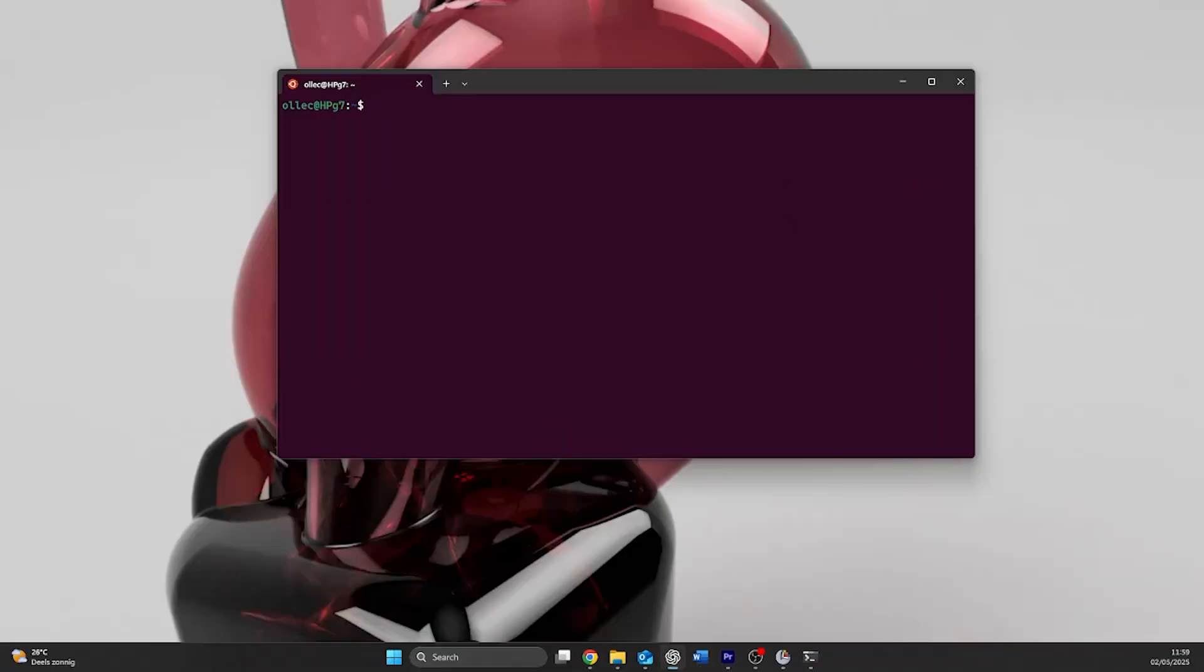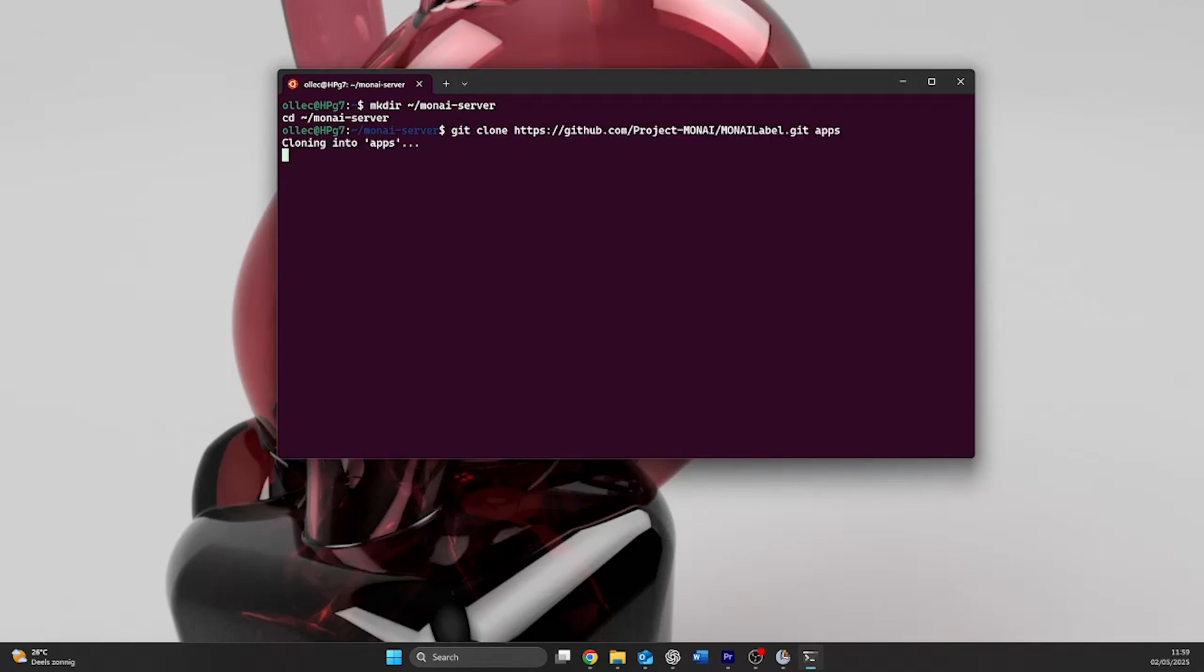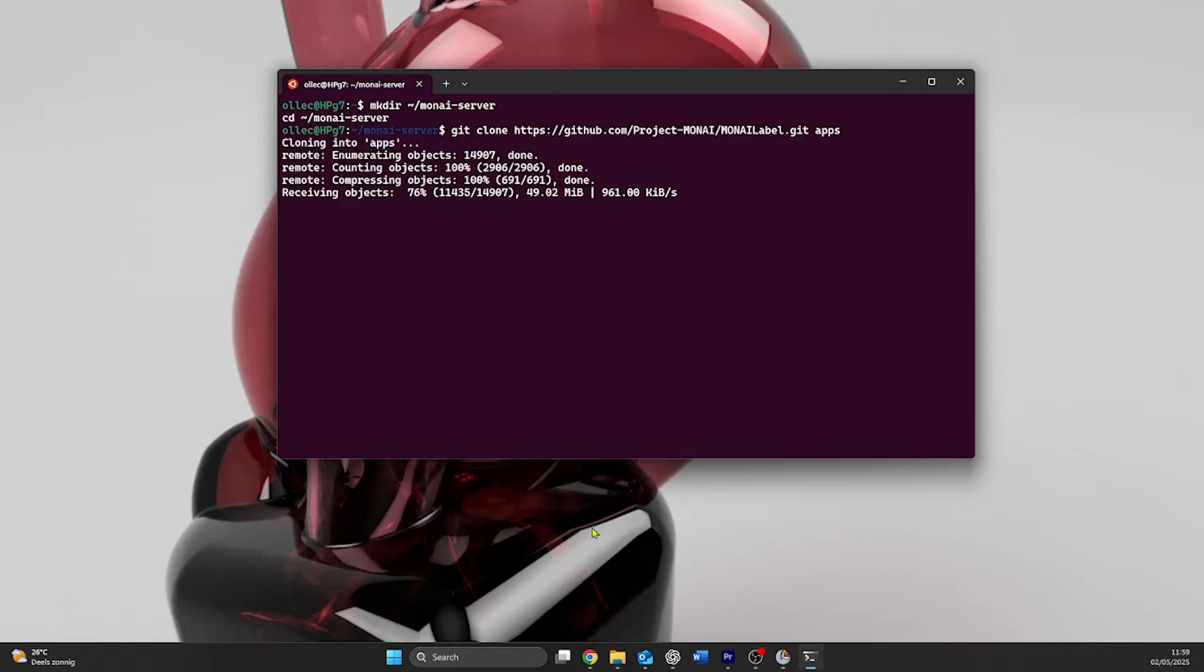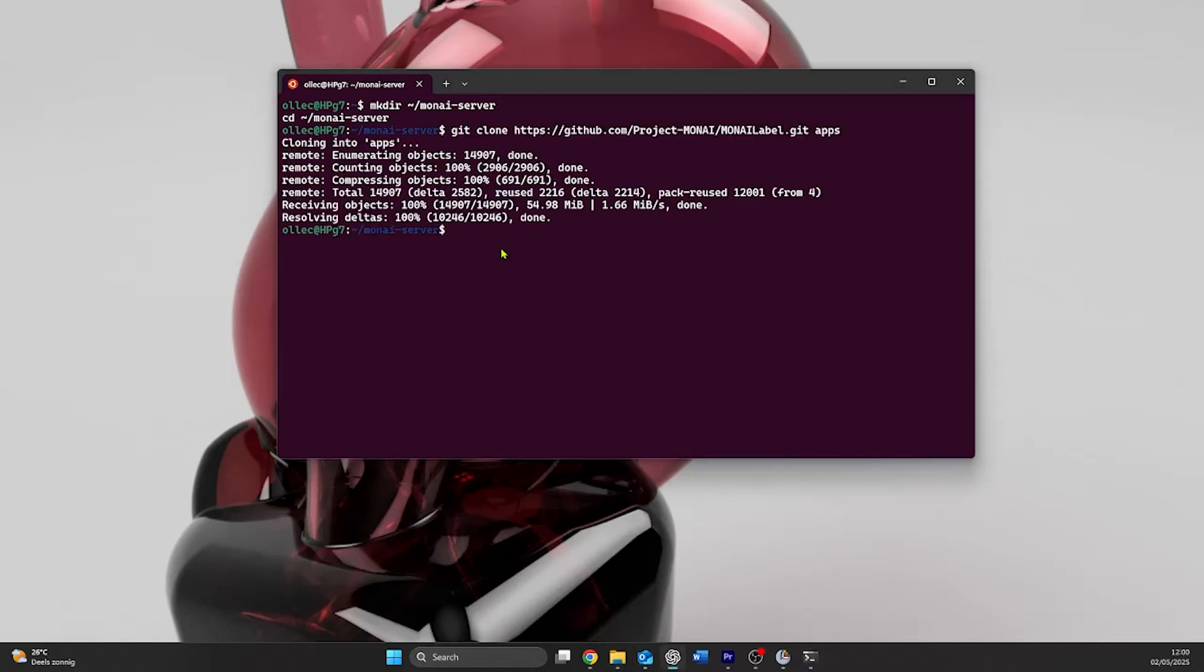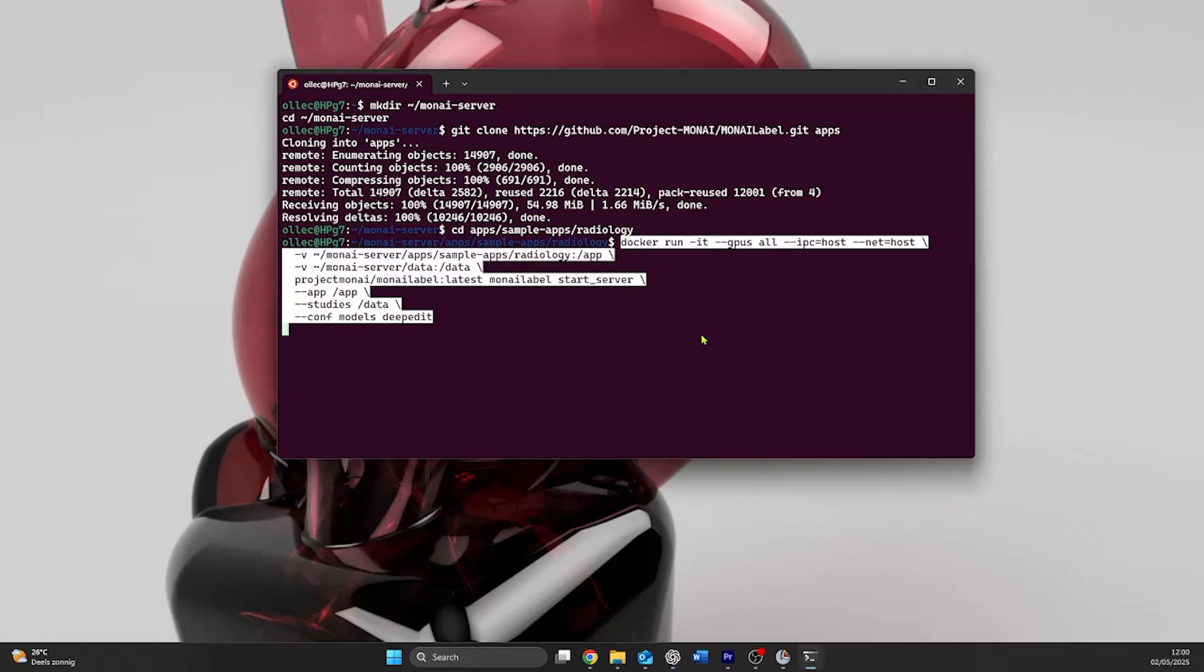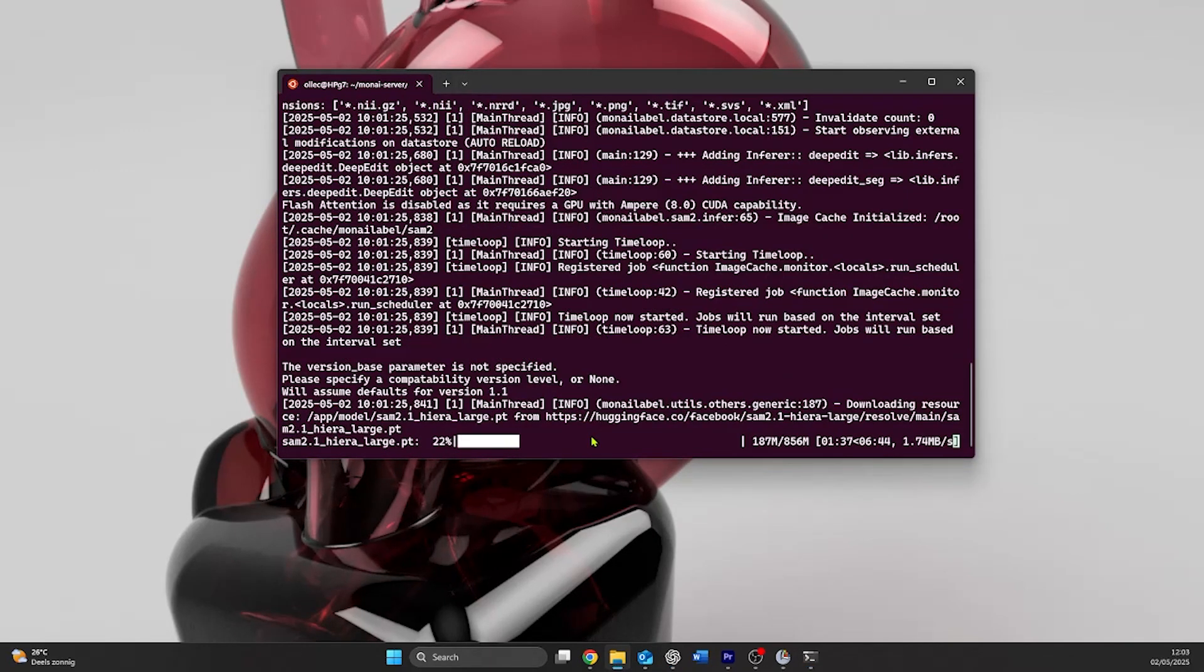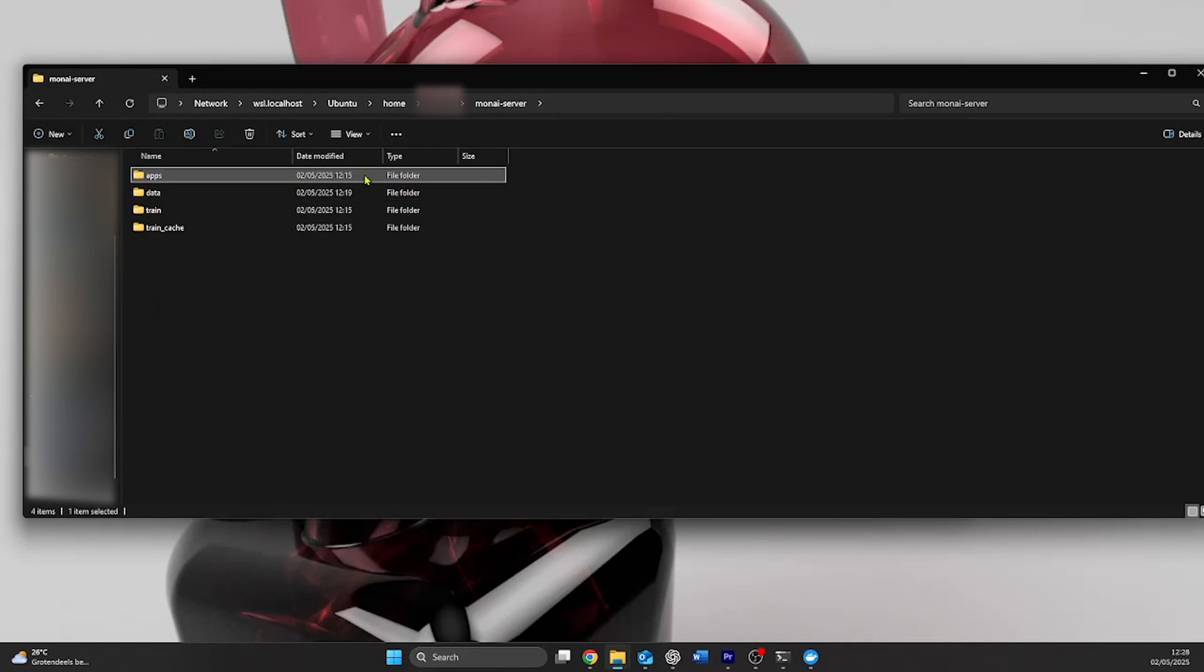Next, we have to download the apps that we will use to train our model from GitHub. We first make a working directory, we set our working directory, and we then put in the code to clone the apps from GitHub to our working folder. After that, we set our working directory to the folder where we can find the app that we will use. This will be the segmentation app in the radiology folder. A quick test run will show that we can now run our server with the correct app. Press Ctrl-C to close the server at the end.